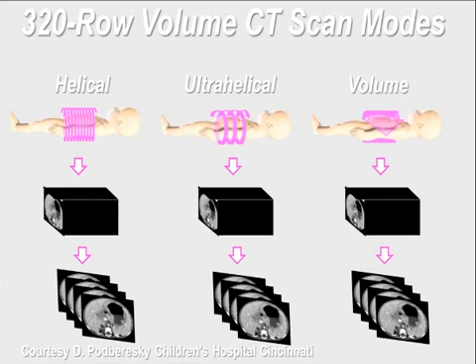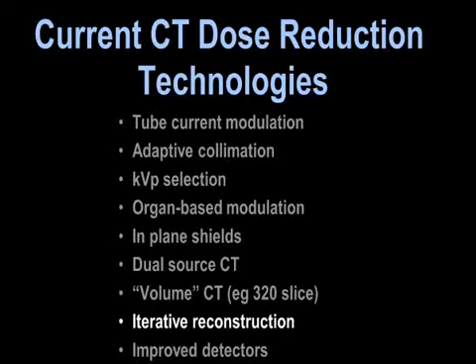Well, a volume acquisition might be a whole abdomen or a whole chest in a child, and with a 0.3 second rotation time, it's not a chest x-ray, but it's pretty doggone quick here. And so this is new technology which has certainly great applications for pediatric body imaging as well.